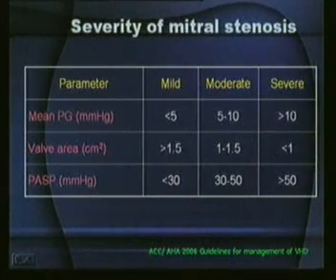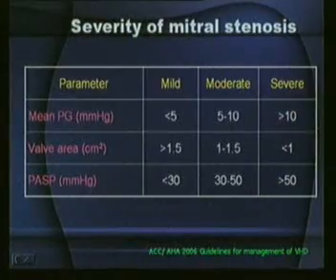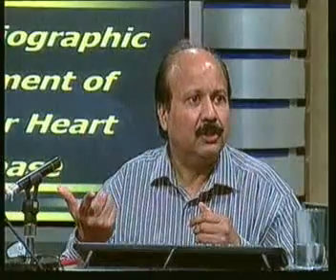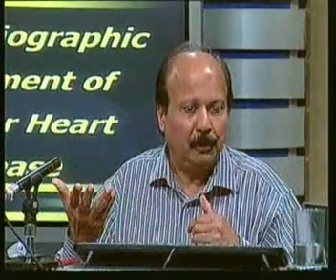So mind you, echocardiography therefore has helped you in so many ways. First, it confirmed your diagnosis, because a mid-diastolic rumbling murmur with a pre-systolic accentuation, a loud first sound, you saw an opening snap, it told you yes, the anterior mitral valve is domed, it is pliable, and we'll come to this, it has helped you.